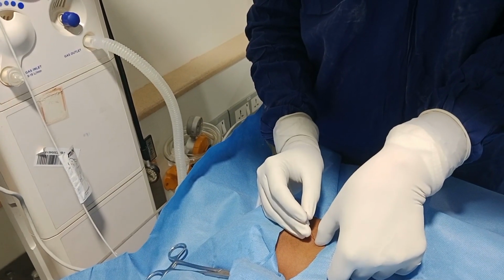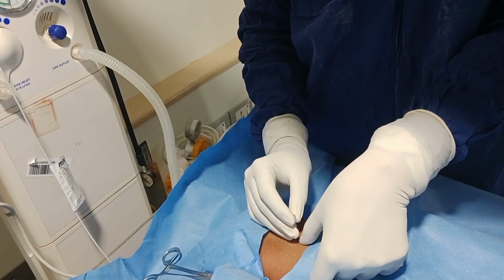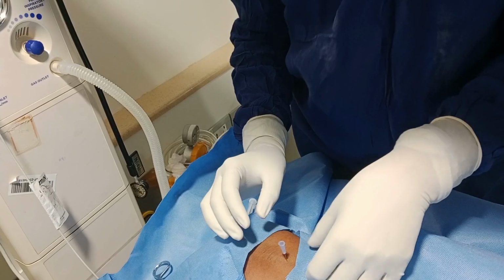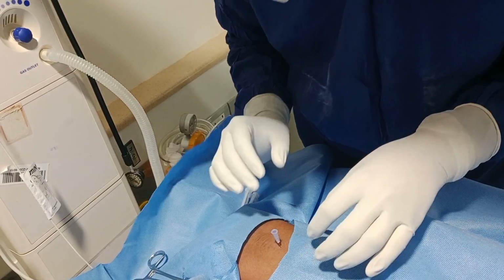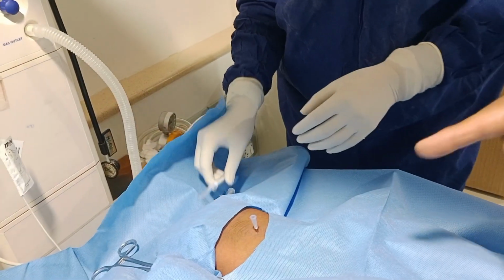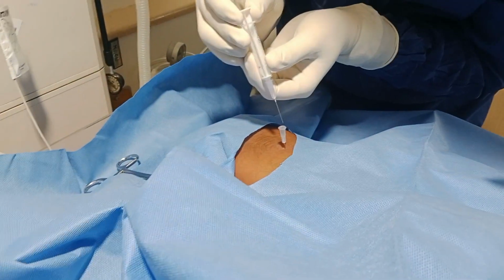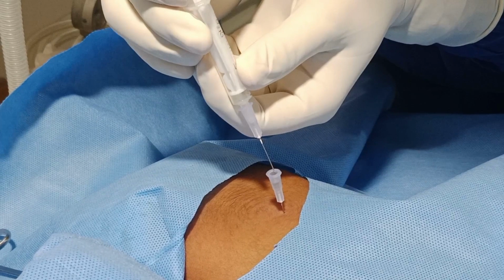Now the needle is being inserted, and that giveaway has come. Now exactly he has gone to around 1.1 centimeter depth. You can see the fluid is coming up. See how beautifully it is coming up. Now he is aspirating.